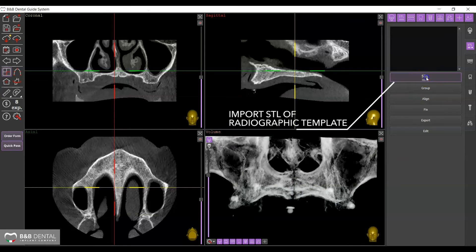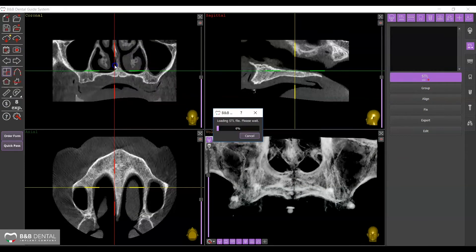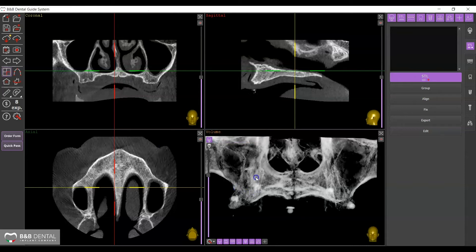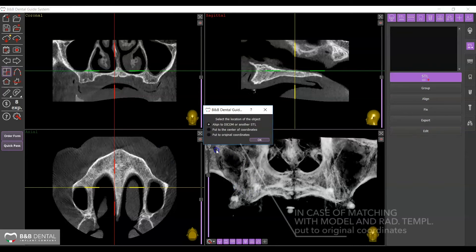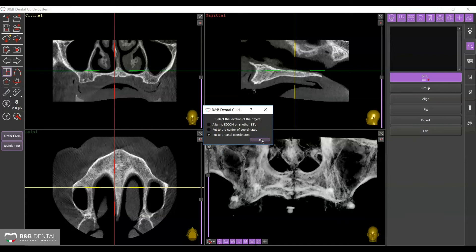Click on Add STL to import the radiological template and select the file corresponding to the treated patient in the folder where you saved it. In cases where the matching of the DICOM and STL files was done by using the model and radiological template, select Put to Original Coordinates from the window and proceed.